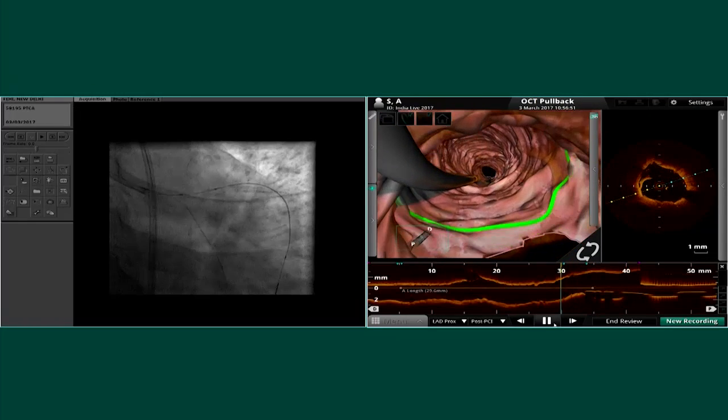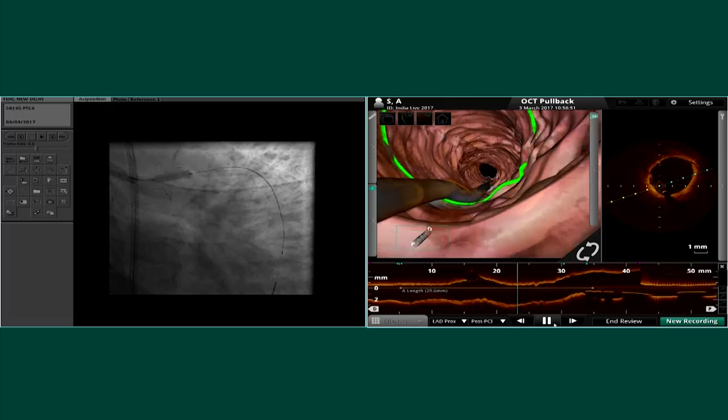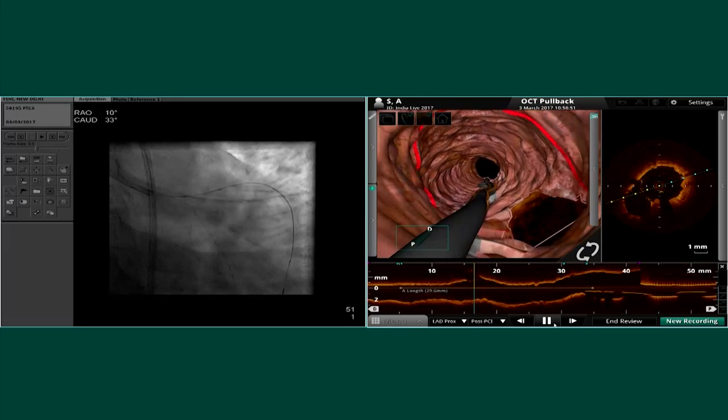Stop here. Make sure that we go up 2, 4, 10, 12, 14, 18, deflate.